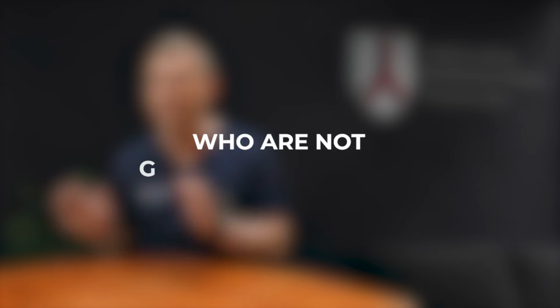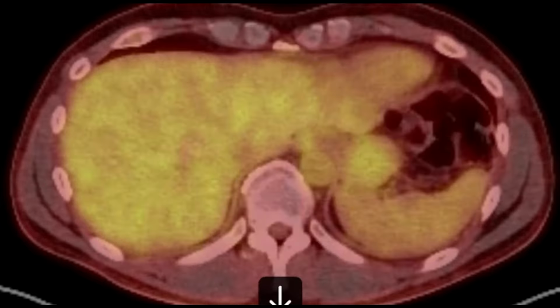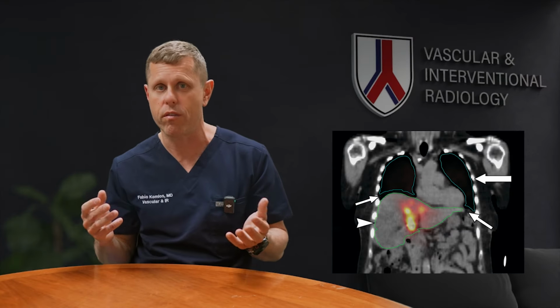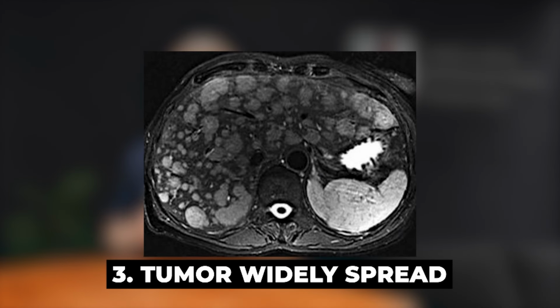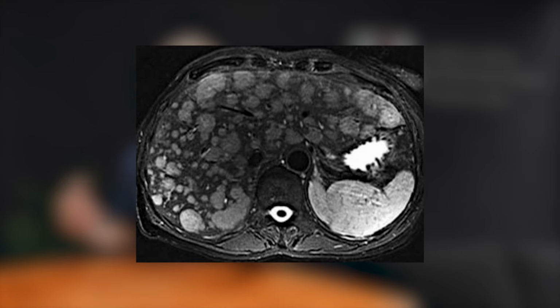So who are not candidates for Y90? One are patients that have very poor liver function, as we talked about before. Two is if we do the mapping and you have a very high lung shunt fraction, let's say 20% of the radiation that we inject will be going to the lungs, then we try to avoid it, because we'll never be able to get enough dose in the tumor without giving a big dose to the lungs. And three, patients that have tumor that is widely spread in the liver and very little normal liver left.